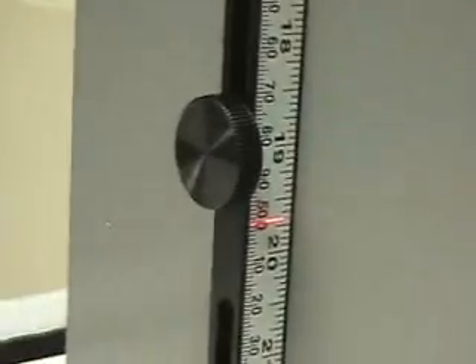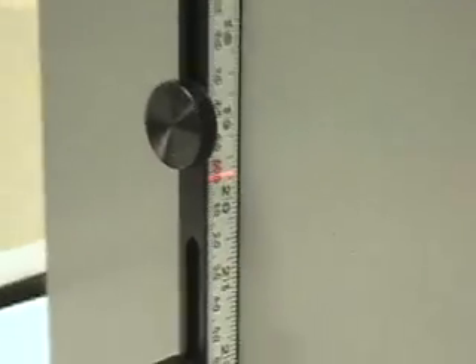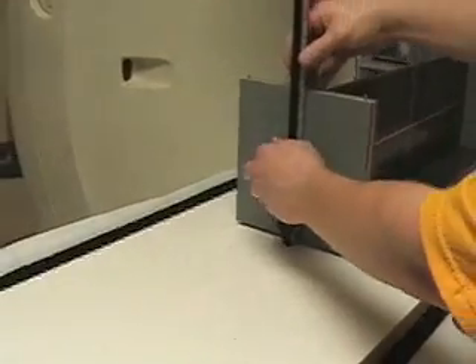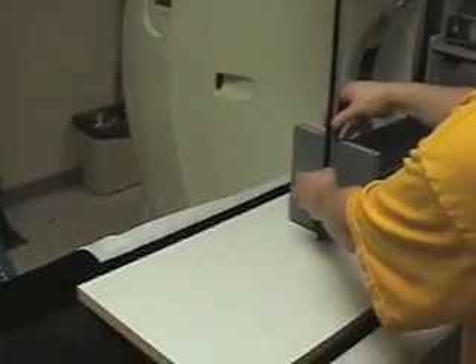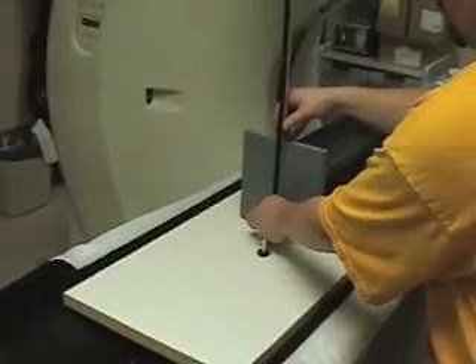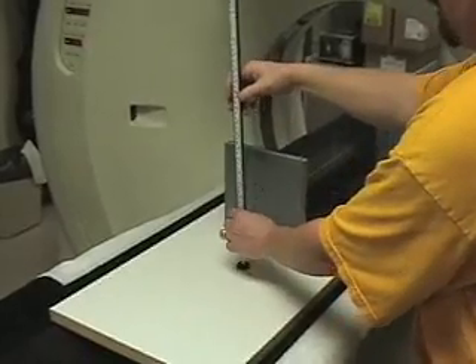Once that's done, we can do the other arm. To do that, we need to take the ruler out and flip it around to the other side. We set it up the same way as we did on this side — lining up the laser to 500. Flip it around.